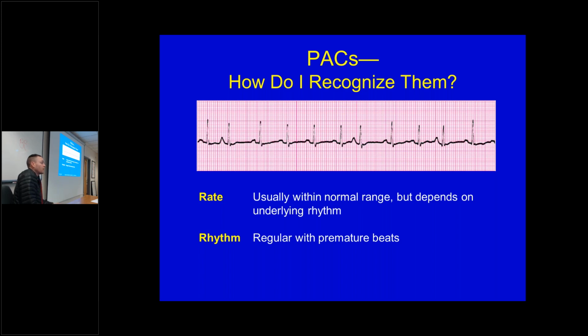So your greater amplitude is a positive deflection, right? So that's going to be if the pathway is towards that positive lead in a straighter direction. When it starts to veer off is when you're going to get different morphology. So it'll depend on which direction it's coming in. So if your lead is out here, and that electricity is either really close to, so it's just not traveling very far and it's coming straight up, or it's in the back wall, so it's kind of coming this way.